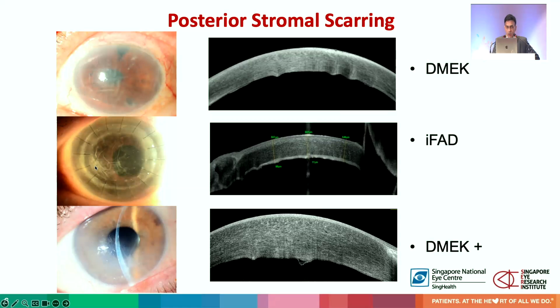While in this case below, related to herpes simplex keratitis, these are fixed folds, and you can see the change in the signal, and the thickness of the fold itself goes all the way up into the base of the lamellar graft. So in this situation, just doing a standard DMEK is not going to help you, and I'll show you how we deal with this.